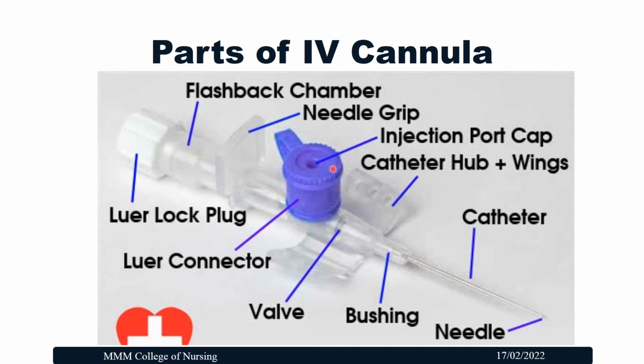And there is an injection port which also has a luer connector. During the IV infusion, if any medication has to be given as a bolus dose, any IV medication can be administered through this port. And there is a needle grip. While we are inserting the needle, it gives proper support to position the IV cannula.